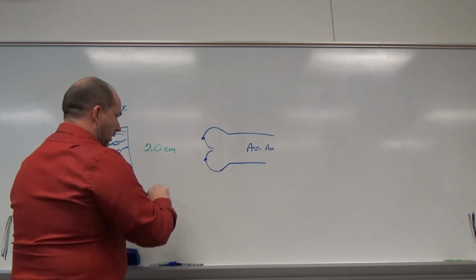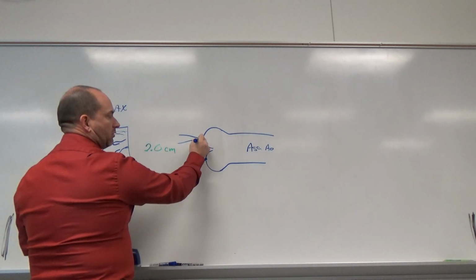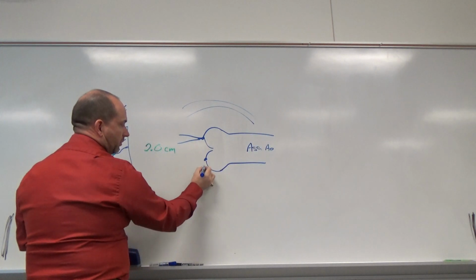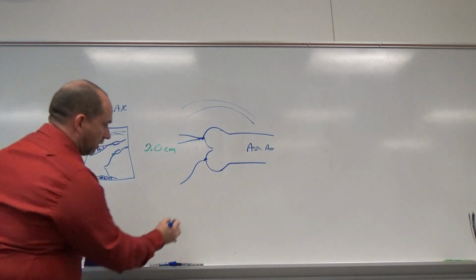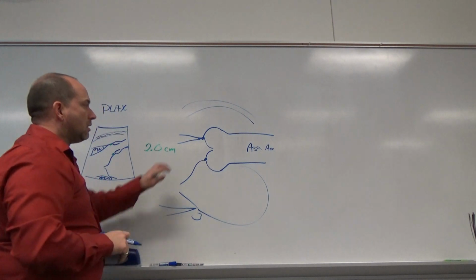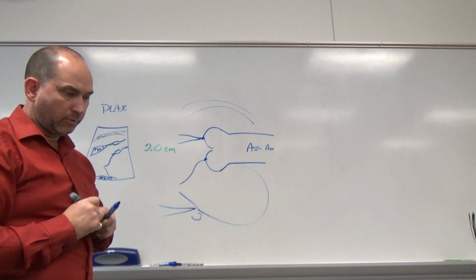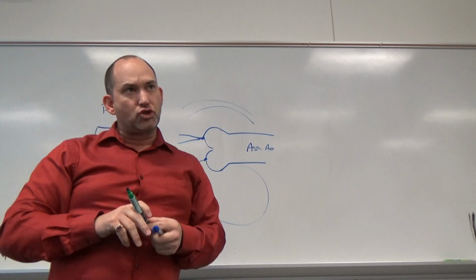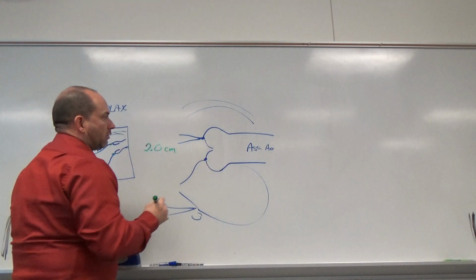And then of course you would come down from here, you would come into the ventricle, the membranous portion of the interventricular septum there. Right ventricle is on this side. And then this comes down and becomes the anterior mitral valve leaflet, posterior, etc., around. What we're interested in the ascending aorta here is we want to be at a higher window than we typically are for even the wall measurements. So we should be really around rib space 2 or 3 to get this nicely level across the screen so you have a good accurate measurement.